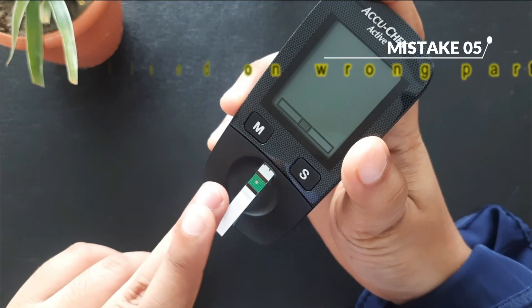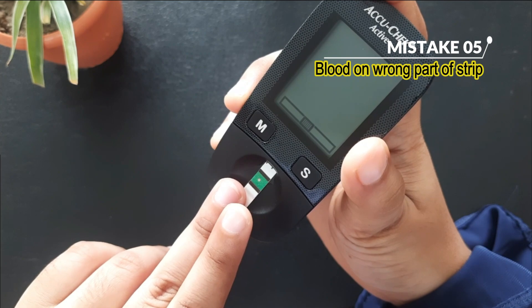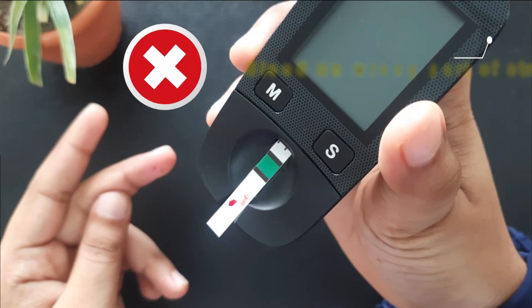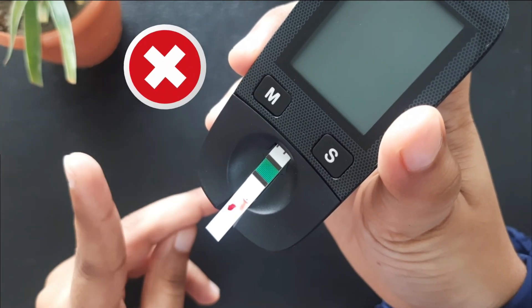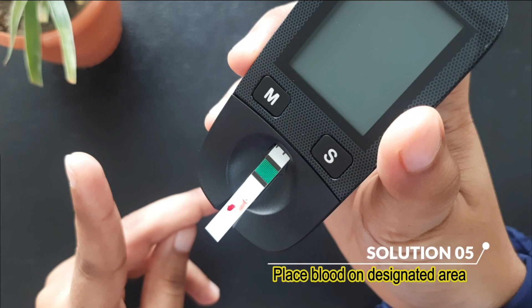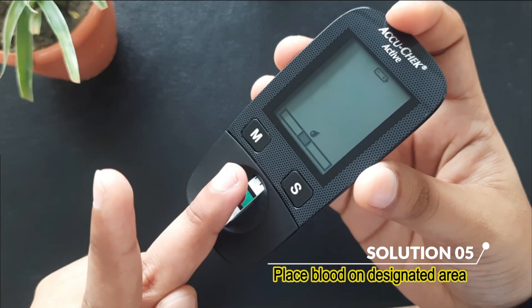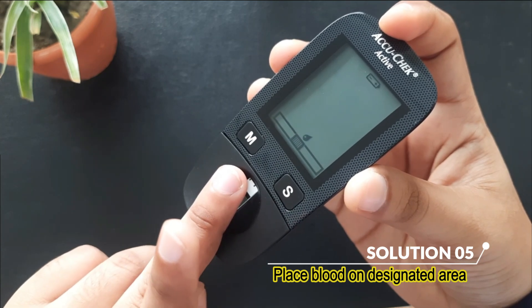Mistake 5: Applying blood to the wrong part of the strip. Solution is, place the blood on the designated area of the strip. Avoid smearing blood on other parts.